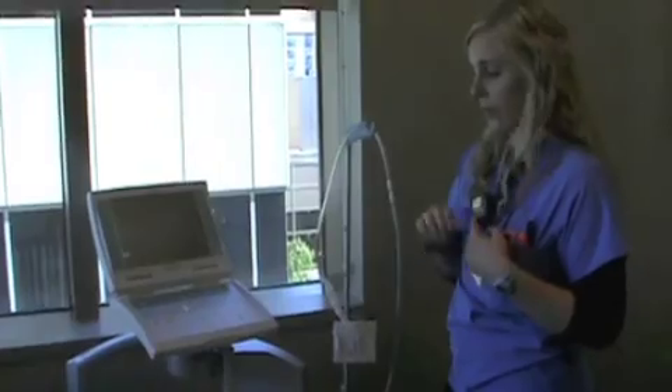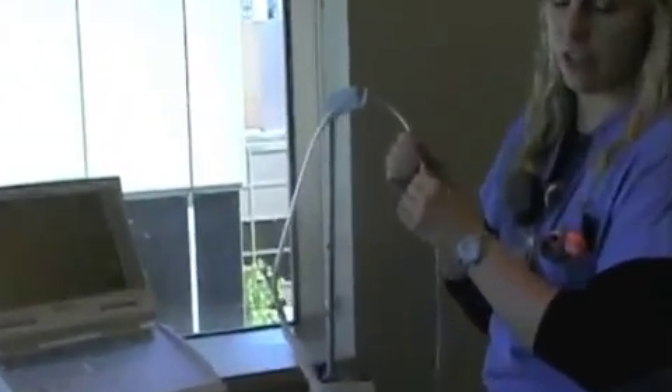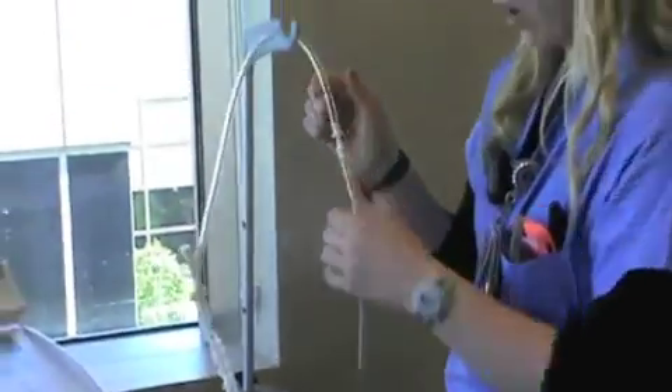The next thing I would check for, if that's not happening, is check your connections. Make sure these are all tight and stable because sometimes that can leak as well. So check all of those.